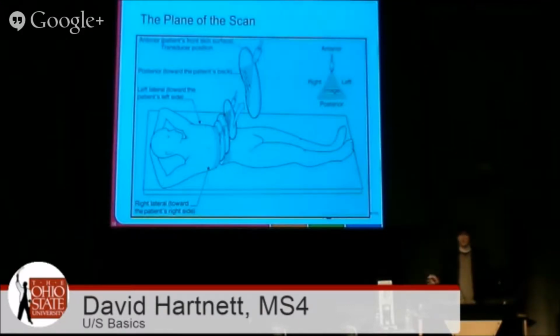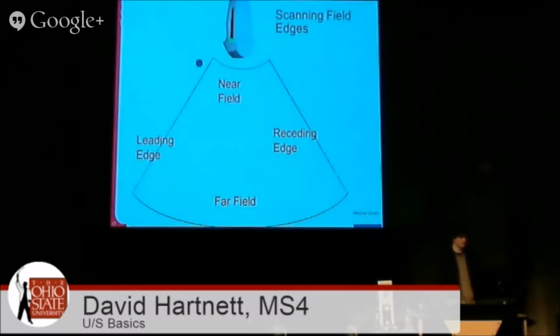So now that we know the different colors and kind of how we get those colors, let's talk about how we're going to actually obtain the images today. With a CT scan, everything's at 90 degrees, everything is the same image. You could get scans in other ways, like a chest x-ray the other way, but we have these standards that make it so that you can read any chest x-ray, and you can understand any CT scan you're looking at. So we do the same thing with ultrasound. Even though you can put the probe on in any way whatsoever, we have a system that makes it so that you can understand the images and the images can communicate themselves.